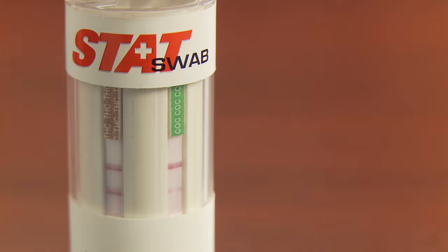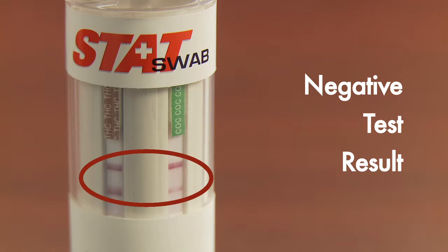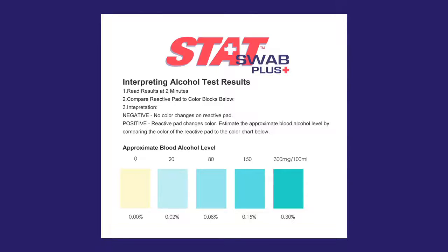If the donor tests negative for the substance, a second red line should appear in the test region. Any line that appears, regardless of color intensity, should be interpreted as a negative result. After 10 minutes, if a second line has not appeared in the bottom test region, this should be interpreted as a preliminary positive result. Any positive STATSWAB result should be considered preliminary and should be confirmed by an alternative method.